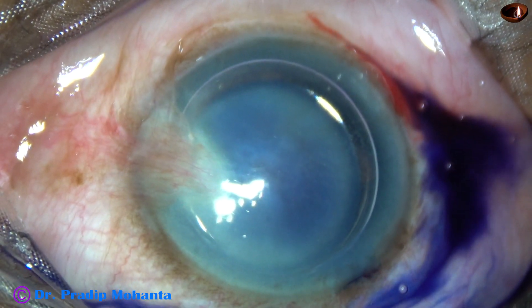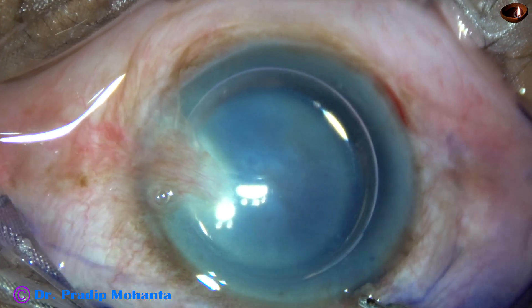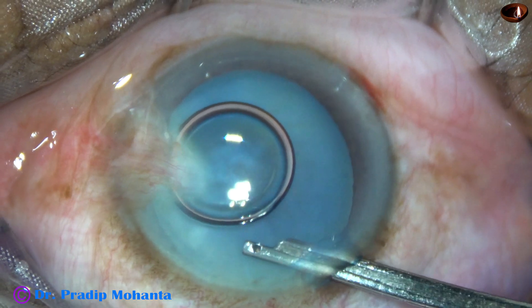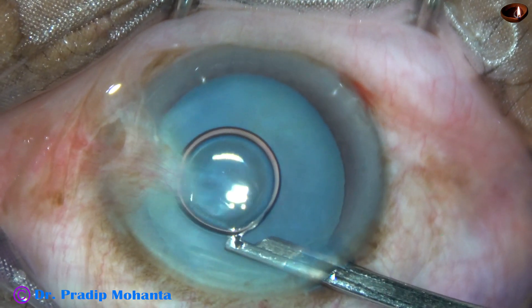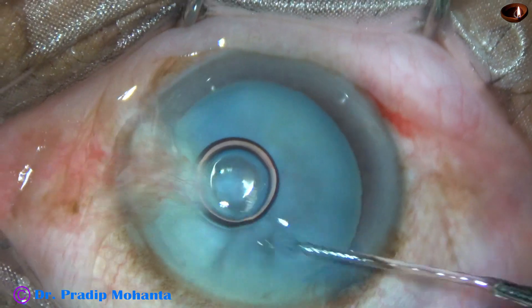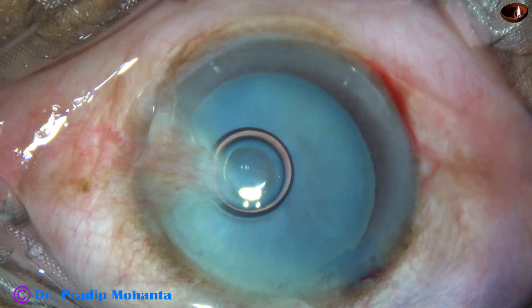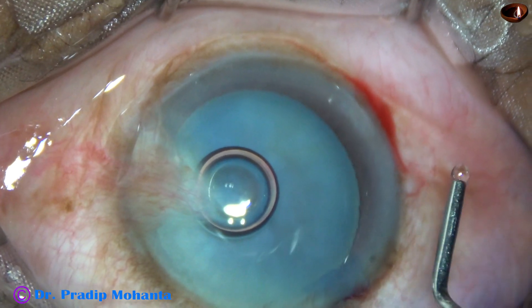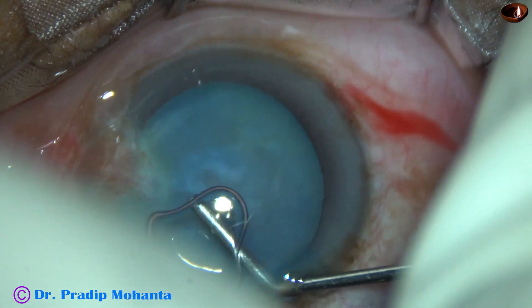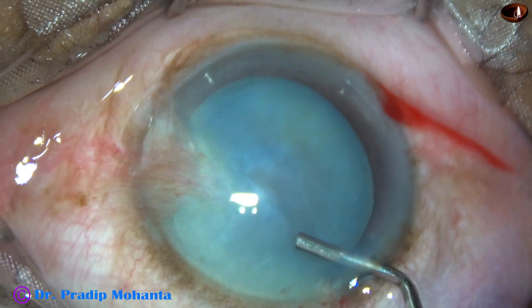By this time, all the incisions have been made. The anterior capsule has been stained underneath an air bubble. Now the dye is washed out with BSS, and after this, 2% hydroxypropylmethylcellulose is injected to fill the anterior chamber. And now we are ready to do capsulorhexis.